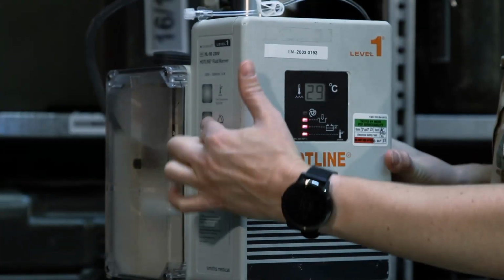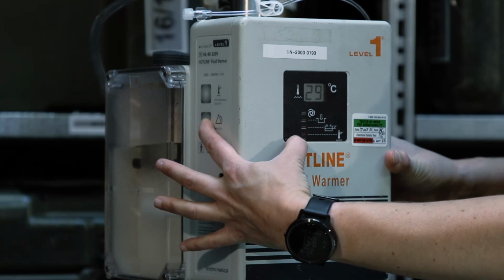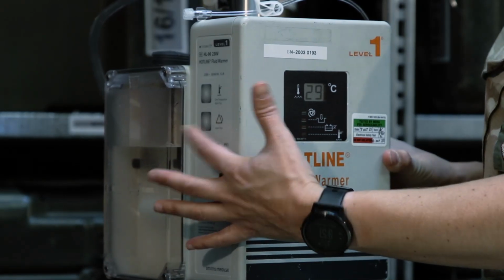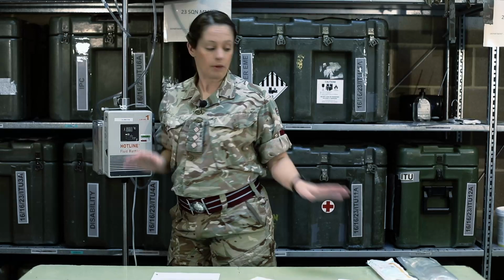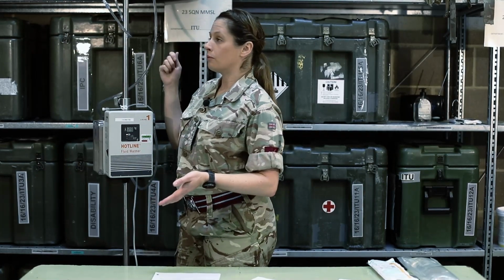So press and hold in, and as you can see, it's stopped circulating, the green light has gone out, all three LEDs have come on, and you can hear the audible alarm. Press and let go, and it goes back to normal working. Whilst I'm waiting for it to get up to temperature, I'm going to get my fluids ready, put some PPE on, and prime the line.